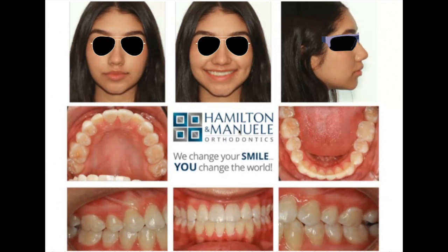We also bracketed the premolars, as you'll see, more incisally so that those could be intruded, so our gingival margin levels could be closer to ideal relative to everything else, with the plan to have the dentist restore those to create normal sized canines at that point. So these are the temporary bondings. This is when we debonded. And you can see the temporary bondings on the central still, which are the canines.